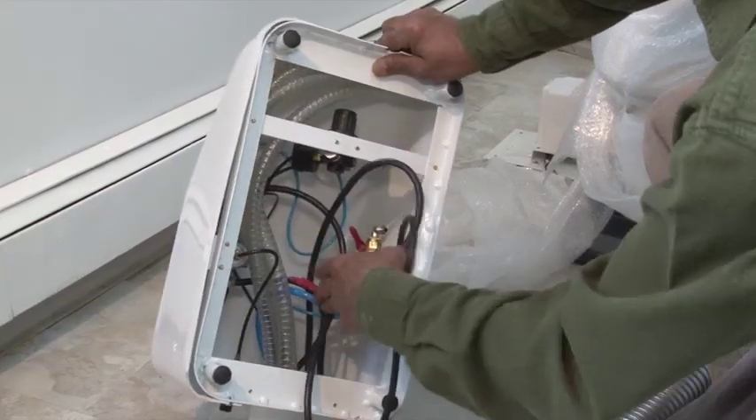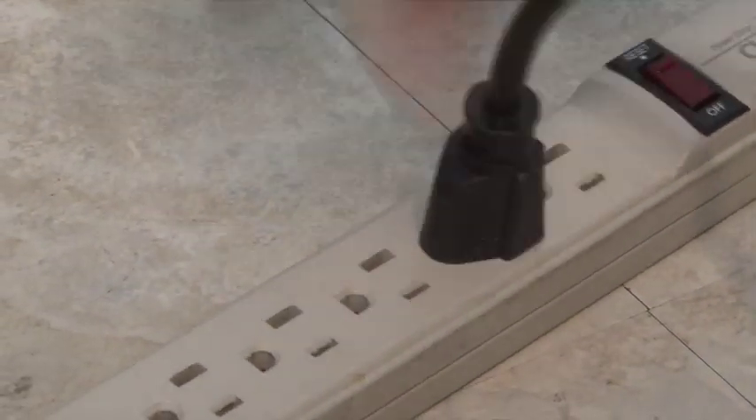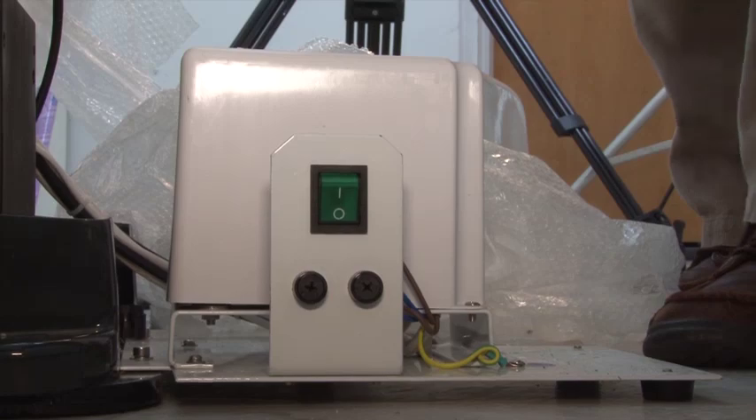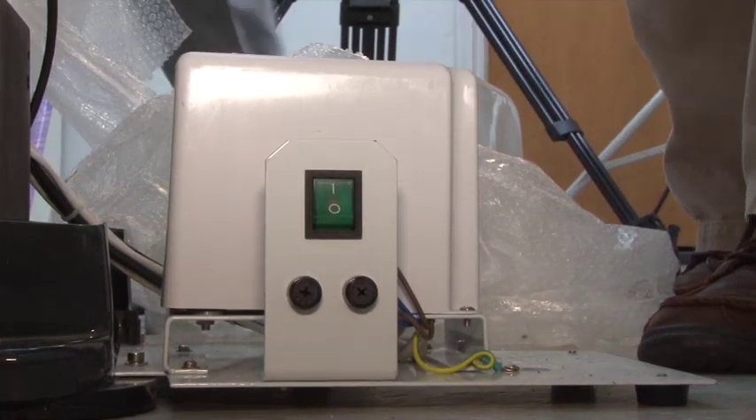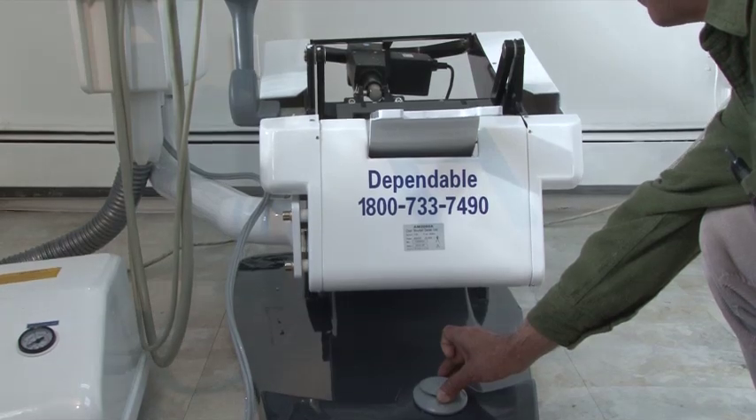Once the chair and all the parts are removed from the box, locate the main power cord in the junction box and plug that cord into a power outlet. Turn on the main power switch so you can move the chair up and down using the joystick controller in the base of the chair.